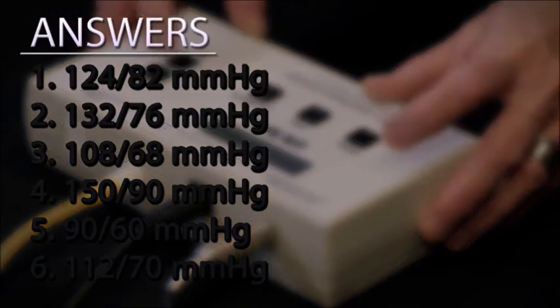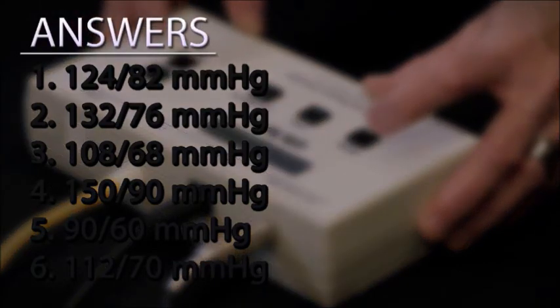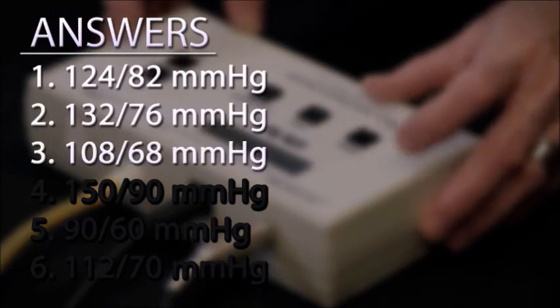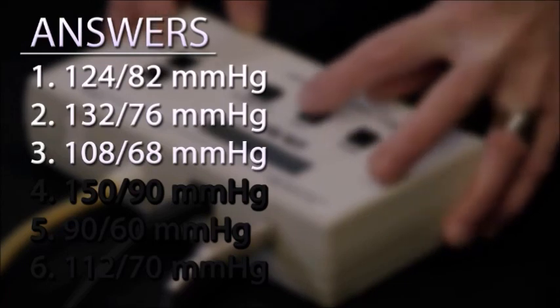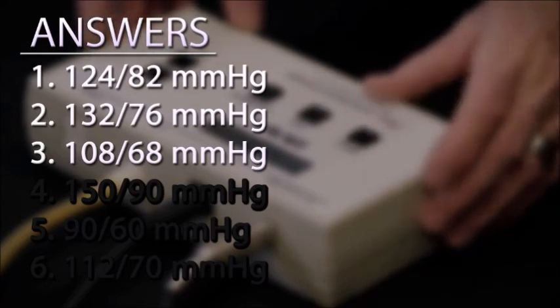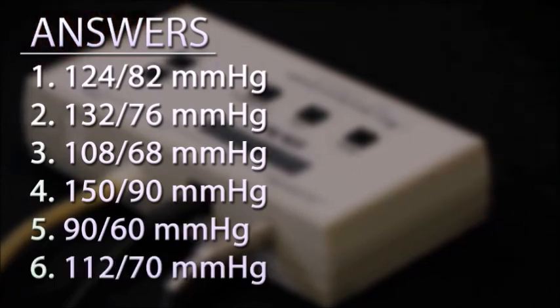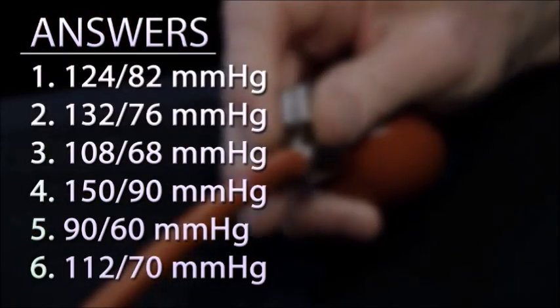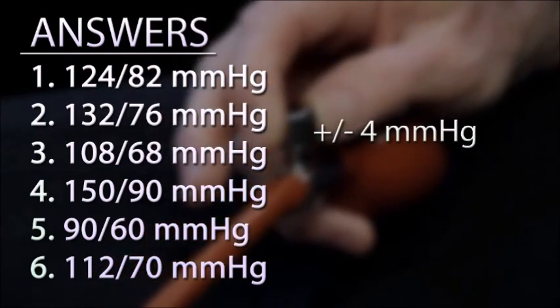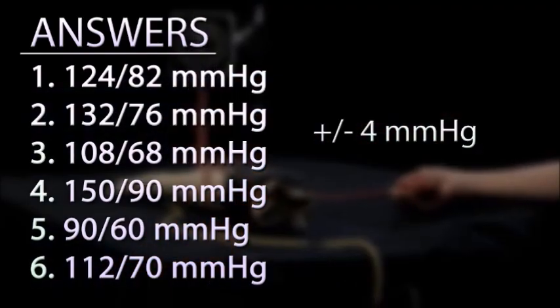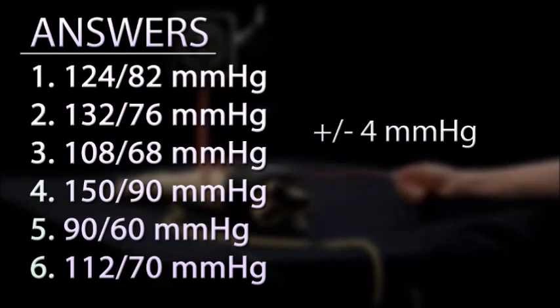Here are the answers to blood pressures 1, 2, and 3. And here are the answers to blood pressures 4, 5, and 6. Did you all come within plus or minus 4 millimeters mercury with your reading compared to the answers? That is the standard for accuracy for our course for the skill of measuring blood pressure.